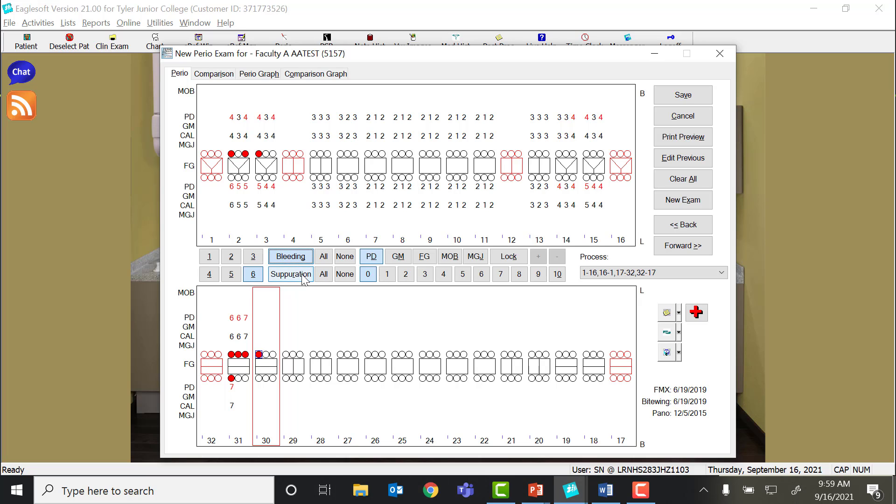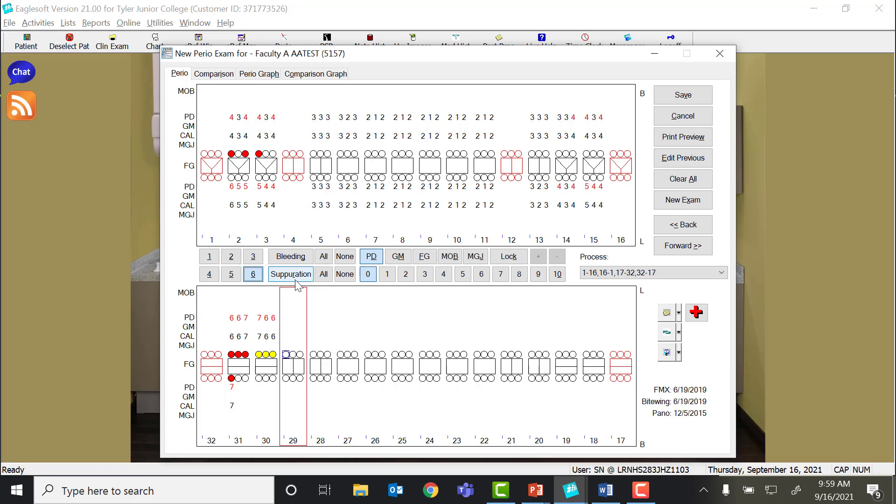For suppuration, if there's actual pus that comes out of the pocket, you will notice that turns the little box yellow. I can click the button and put it in there, or the R is underlined, I can do R and the number.